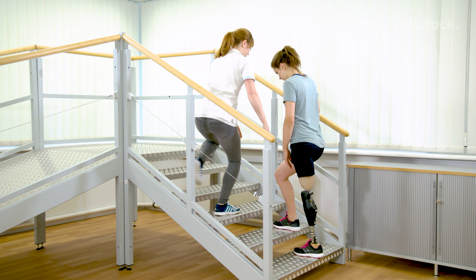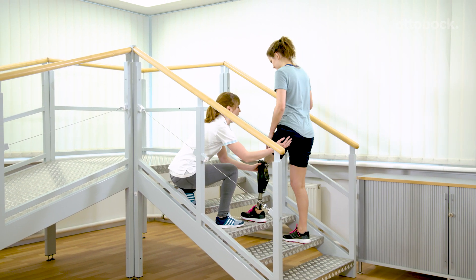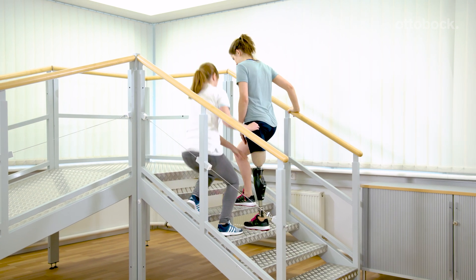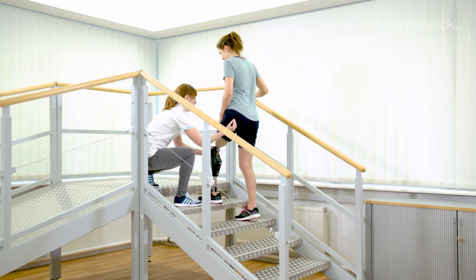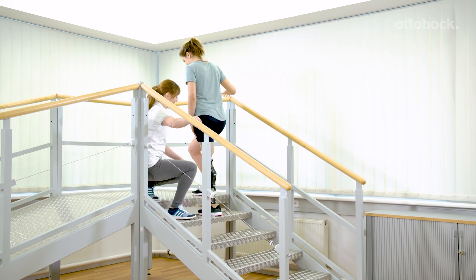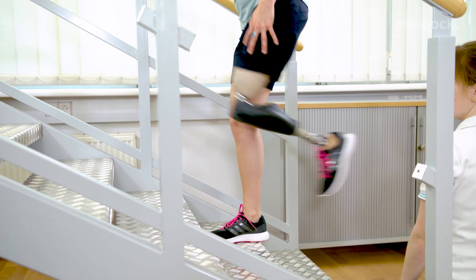Whether the stairs function can be used well is dependent upon stump length, muscle power, socket fit, step height, and body height. At the beginning, even a few steps are exhausting and a strength training program for hip extensor muscles can be implemented.